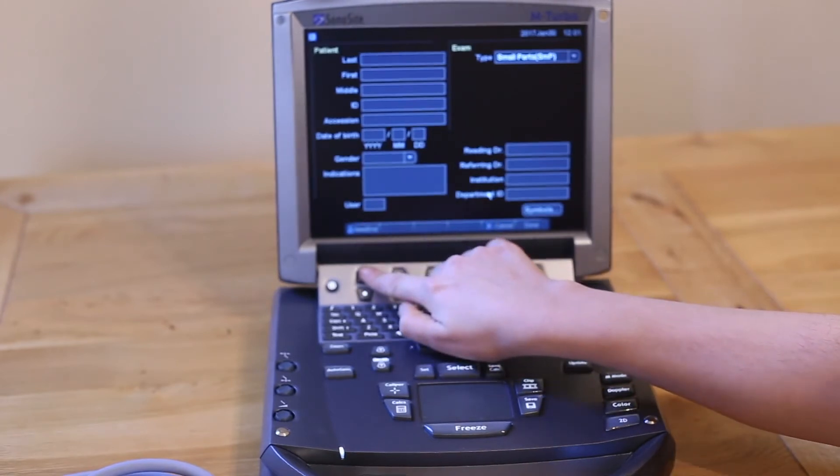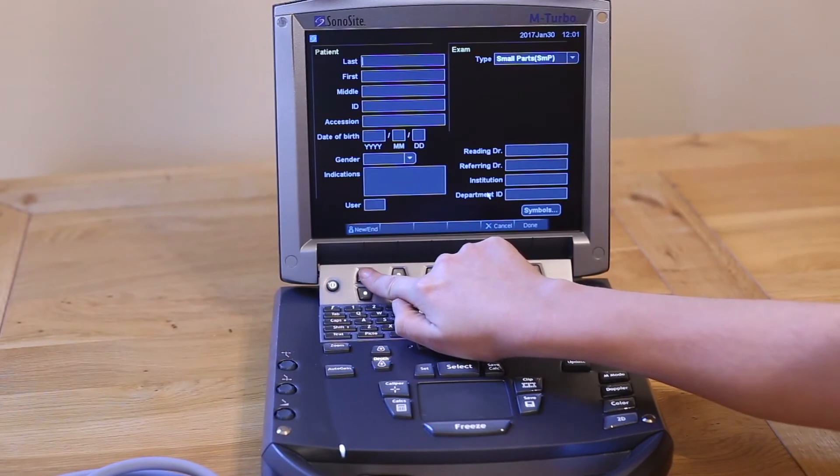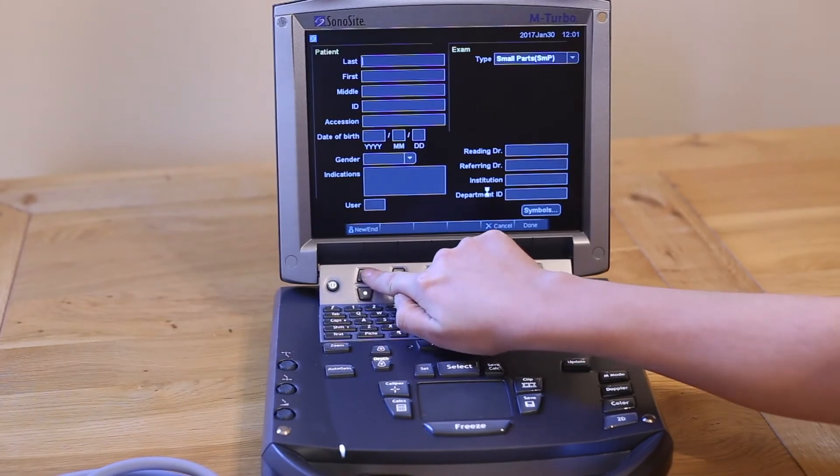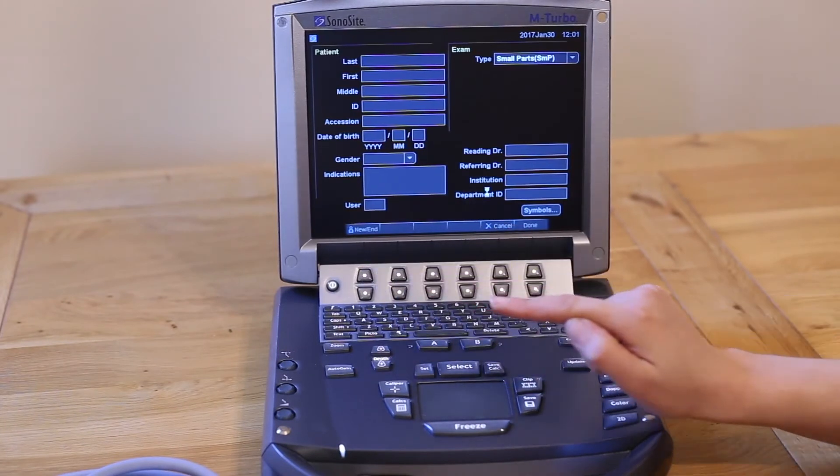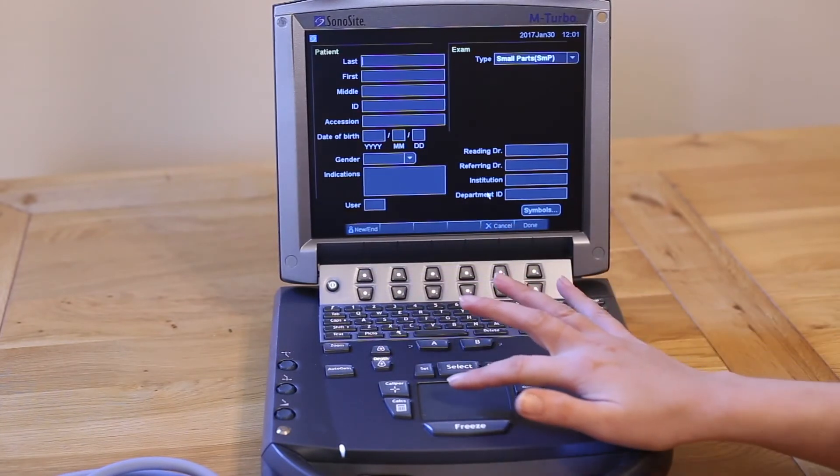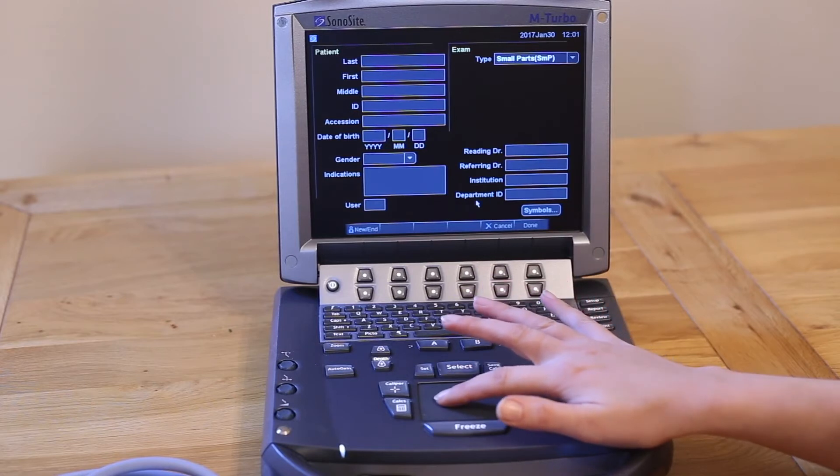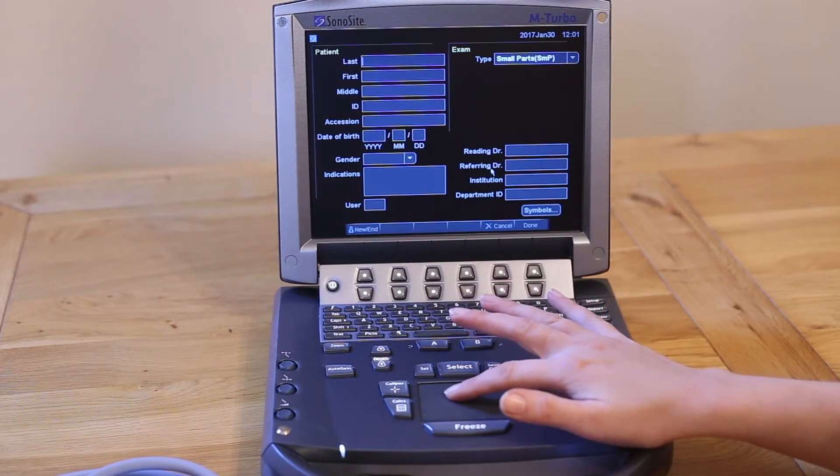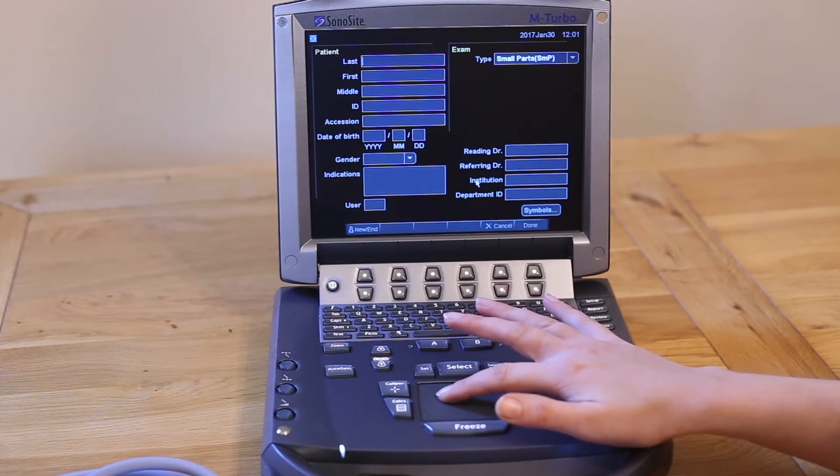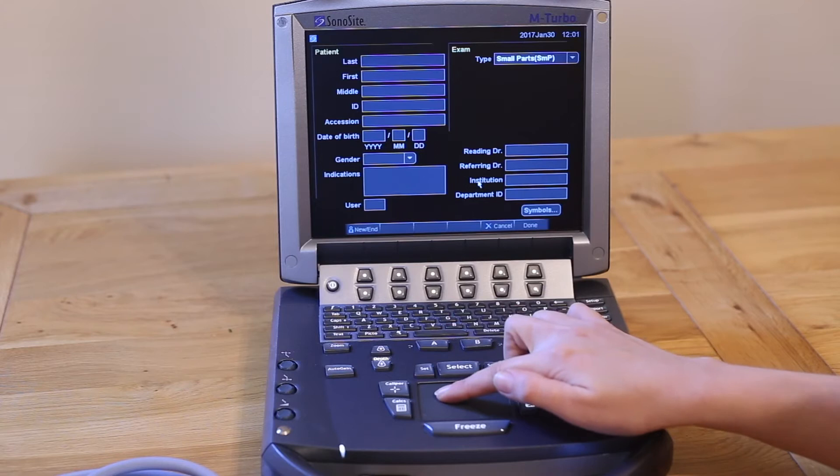Press this button to add a new patient. Use the trackpad in the same way you would use one on a laptop to hover over a box, and press the select button at the top of the trackpad to select a box.